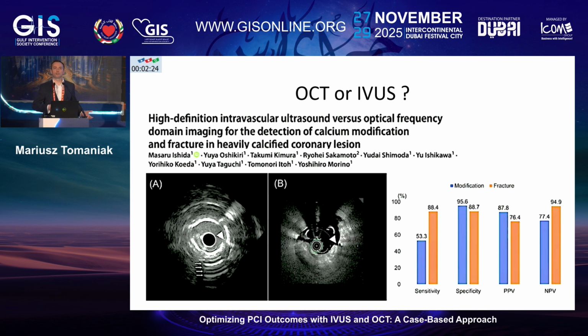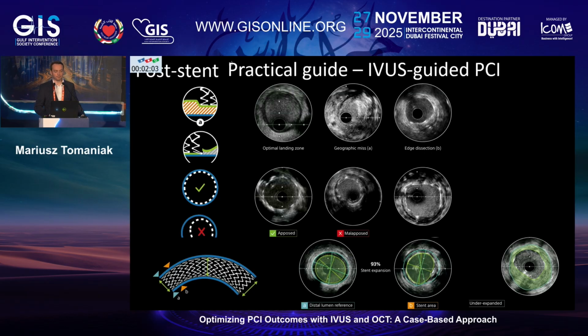Which is better, OCT or IVUS? We sometimes are asked such a question, and I think this study elegantly addressed it, showing that high definition IVUS is equally precise as OCT in identification of calcified plaque, as well as in confirmation of adequate plaque preparation.